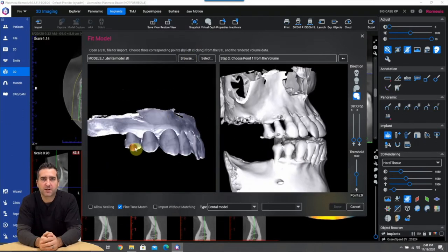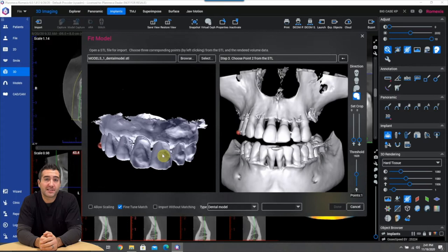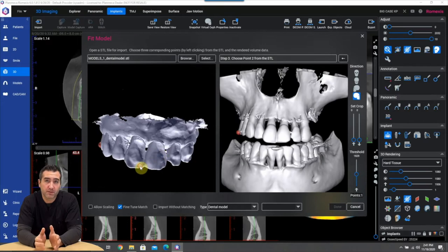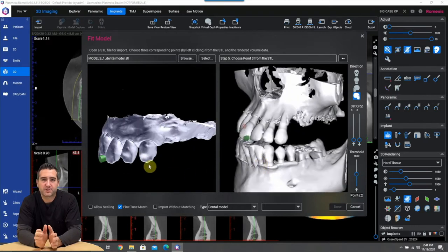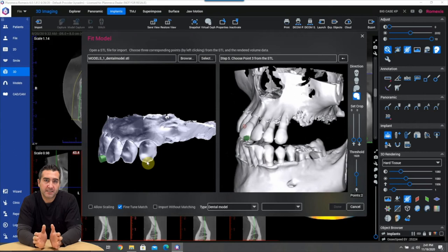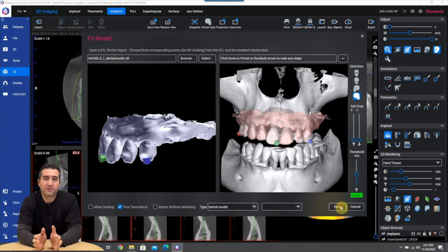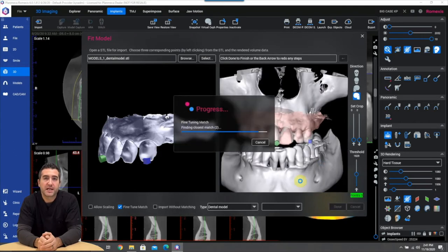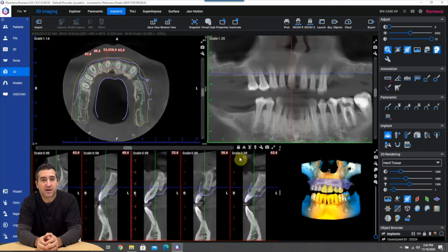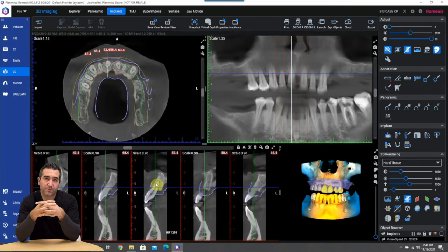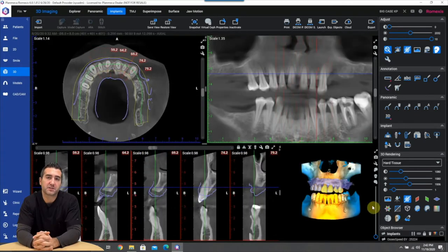So let's talk it through the steps. The first step is you're going to merge the intraoral scan with the CBCT and to do this in Romexis you just basically any CBCT, any STL, it's all open. You click three points and Romexis is going to go through an iterative closest point best fit algorithm and just finalize that fit. It's going to be perfect.